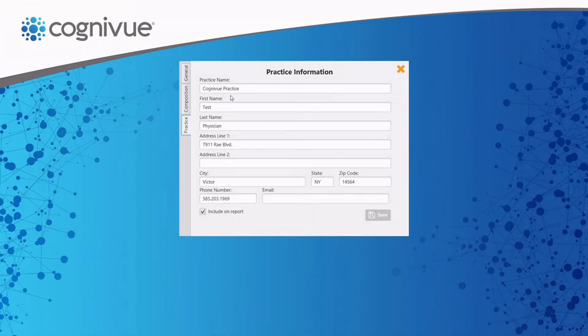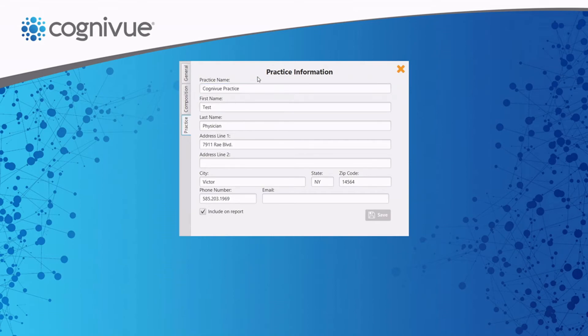Additionally, this is where users can add practice contact information so that patients and other practitioners can follow up on reports.